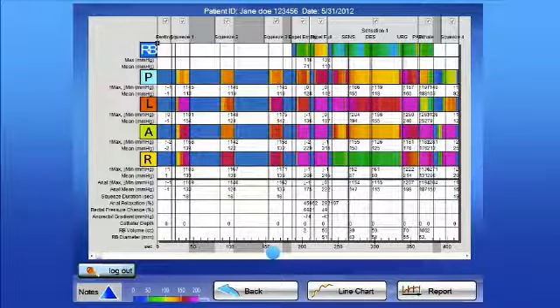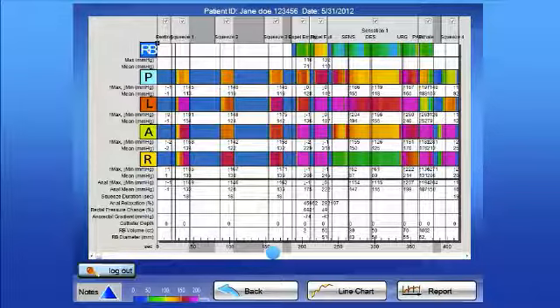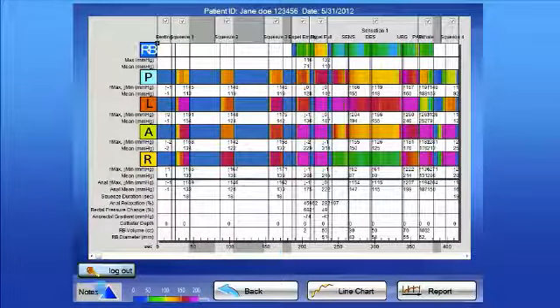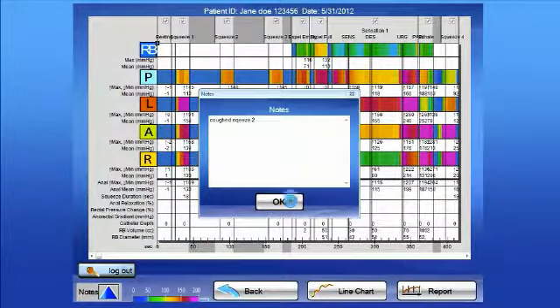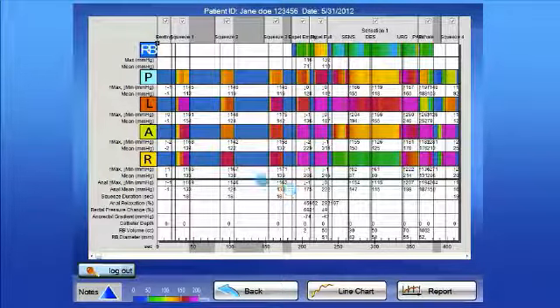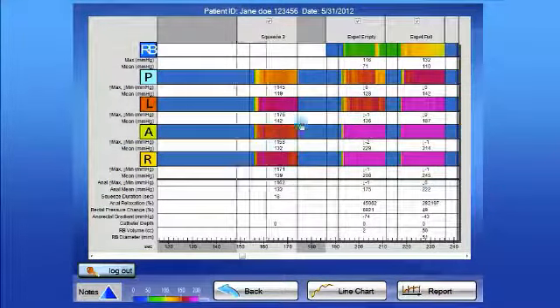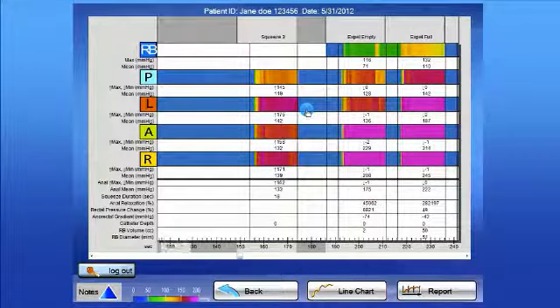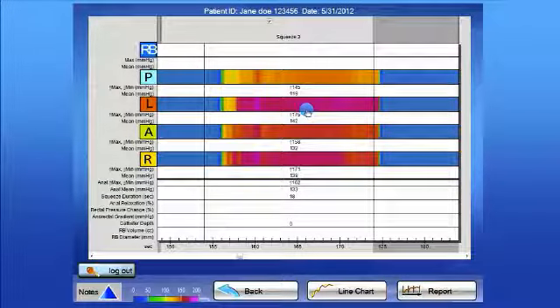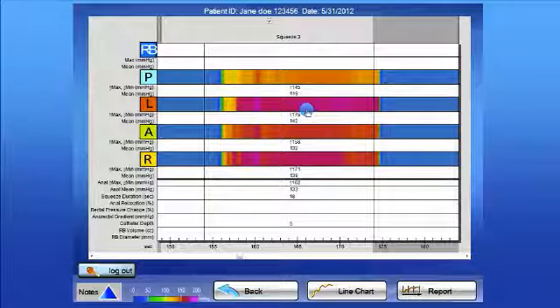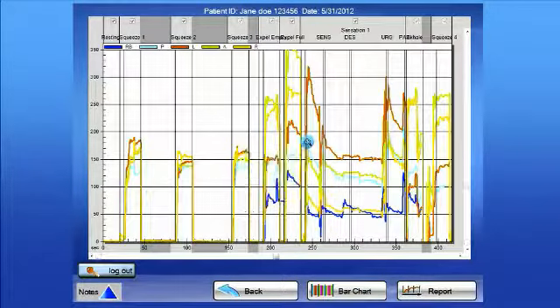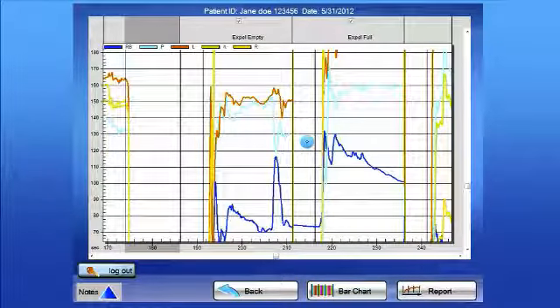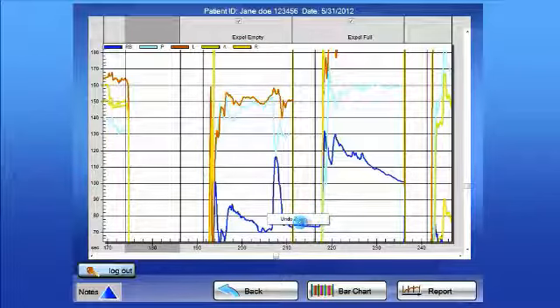You are not able to change the data at this time, but you are able to add interpretation notes if you choose to do so. You can zoom in if you want to zoom a particular area, just like you did when you were doing the original test. The interpreter can also zoom in to see the same level of detail. They can also change to a bar chart if they desire, in addition to zooming in.